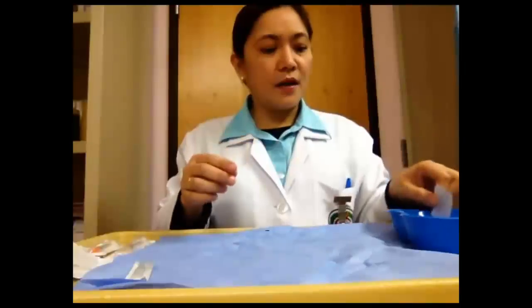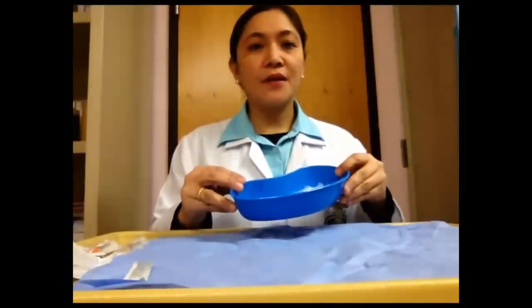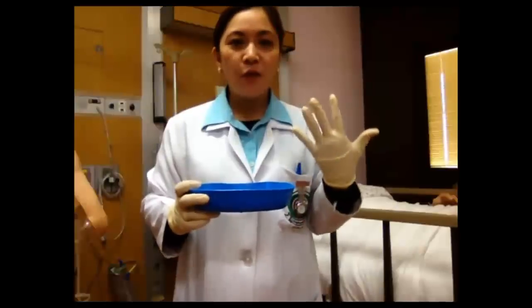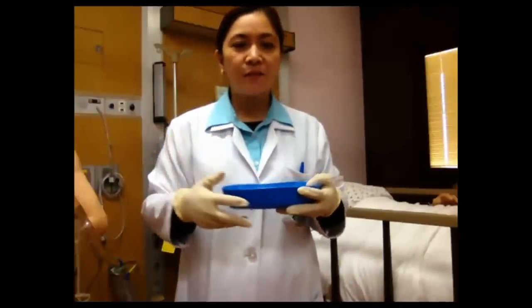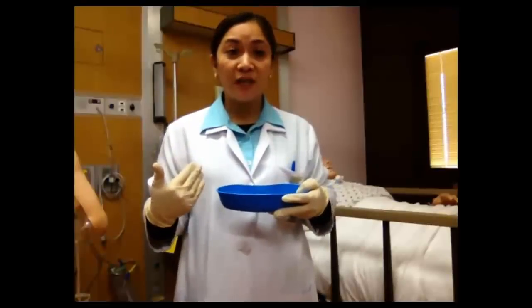Again, place another alcohol wipe and another band-aid to be placed on your patient's injection site after giving the injection. So, our medication now is ready, and we can go now to the patient's room. We can wear unsterile gloves as optional, but it is better we wear them for our own protection.